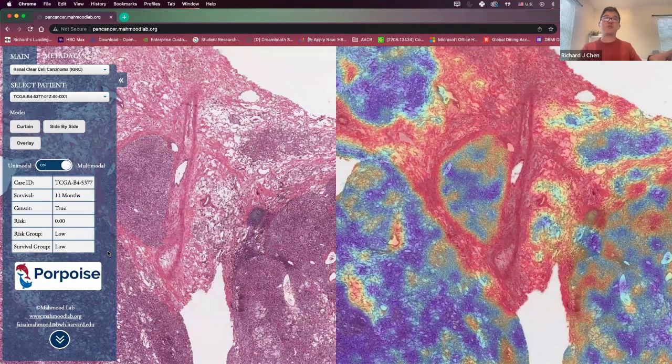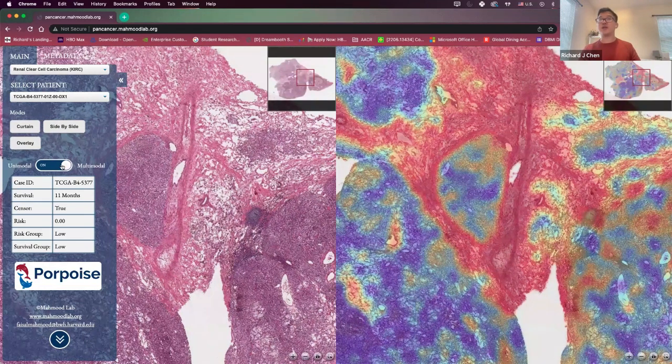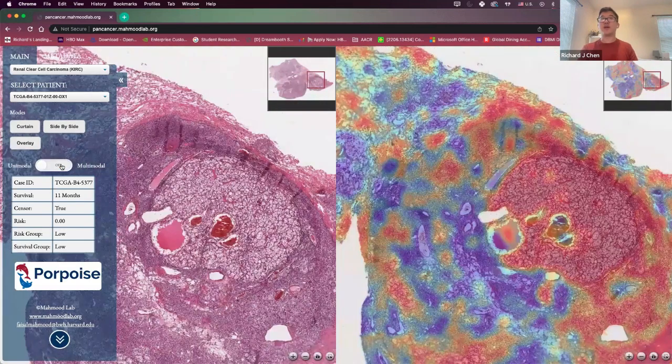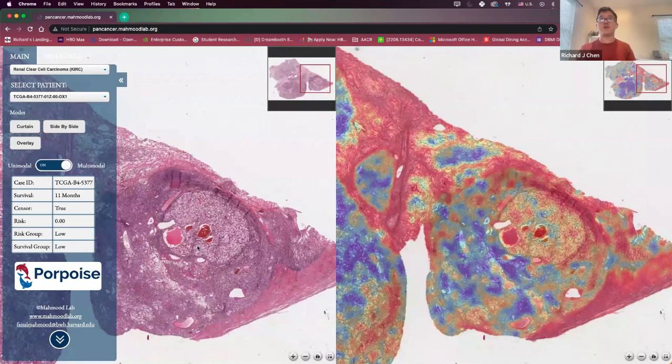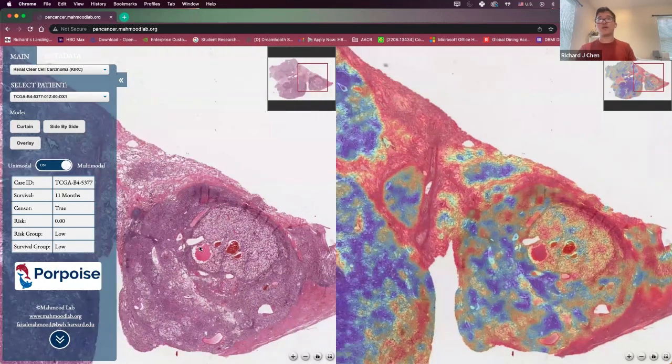Because that tumor information is made available on the genomic side, when it's trying to find prognostic features in the histology, it doesn't need to attend to where the tumor is, because that information is already given on the genomic side. So in a way, I view genomic information as almost being a shortcut in multimodal learning.